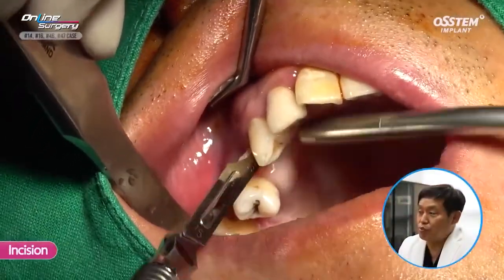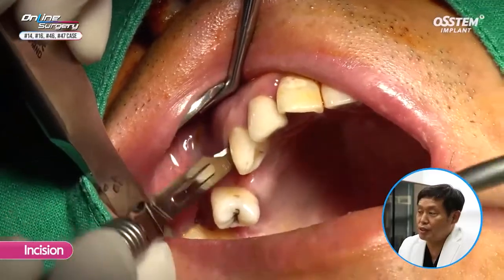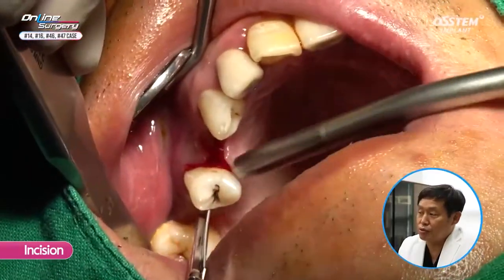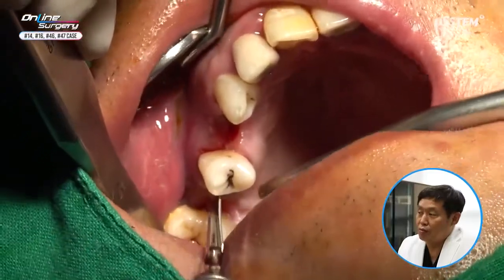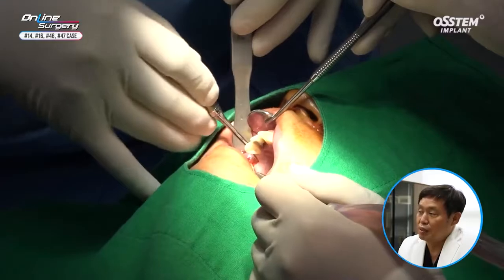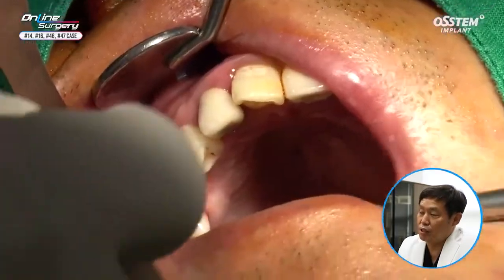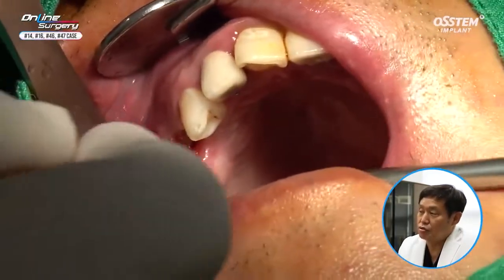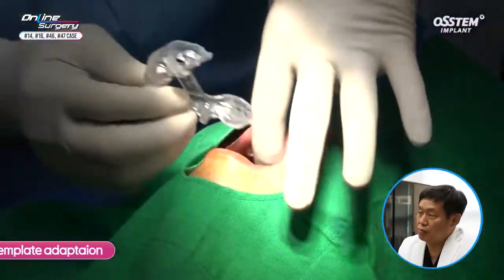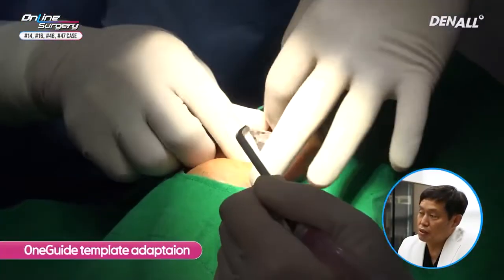Number 14 and 16. Implants will be placed and GBR will be done. Palatal incision is made. Minor flap is reflected so that the drill can go in. OneGuide template will be adapted and surgery will be conducted. I am checking the adaptation.